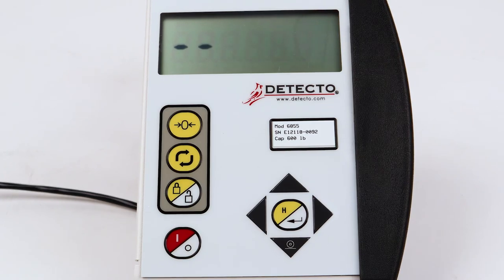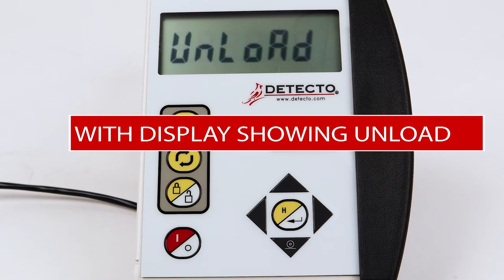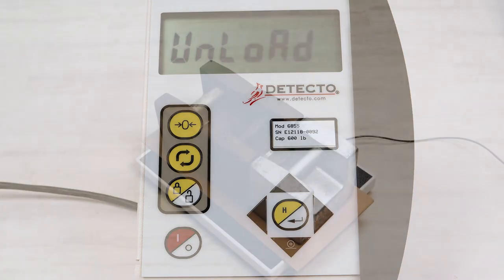Starting at the left and proceeding right, a series of dashes will appear on the display. The dashes will stay on momentarily and then disappear. With the display showing UNLOAD for unload calibration weight, remove your test weight from the scale platform.